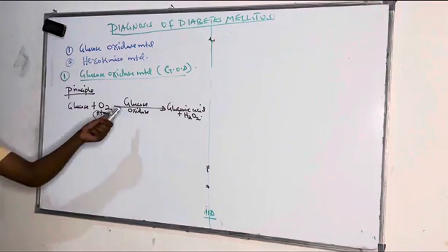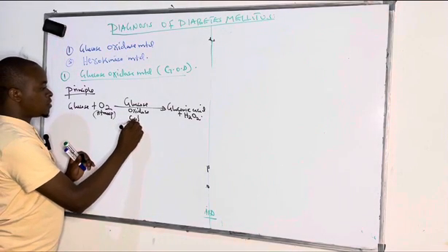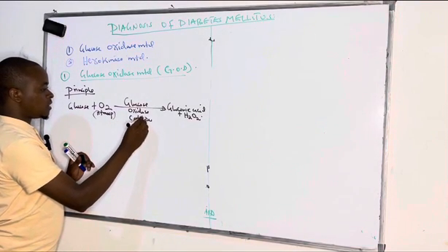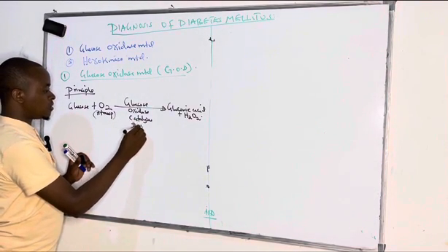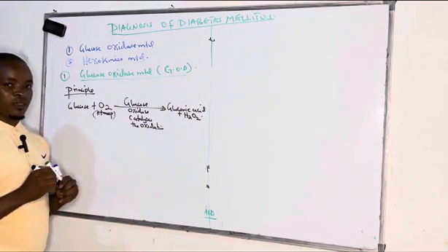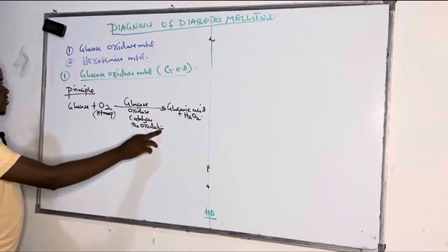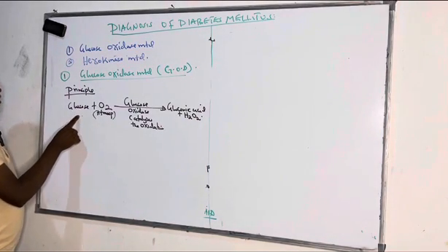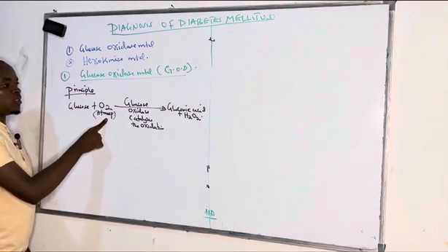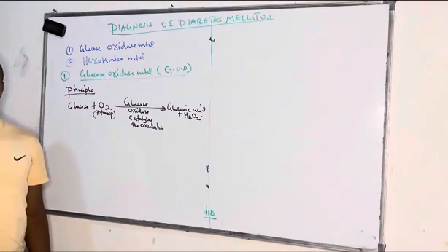So we are seeing glucose oxidase, it catalyzes. The term here we use is catalyzes the oxidation. So the glucose oxidase enzyme catalyzes the oxidation of glucose in the presence of atmospheric oxygen to form gluconic acid and hydrogen peroxide.